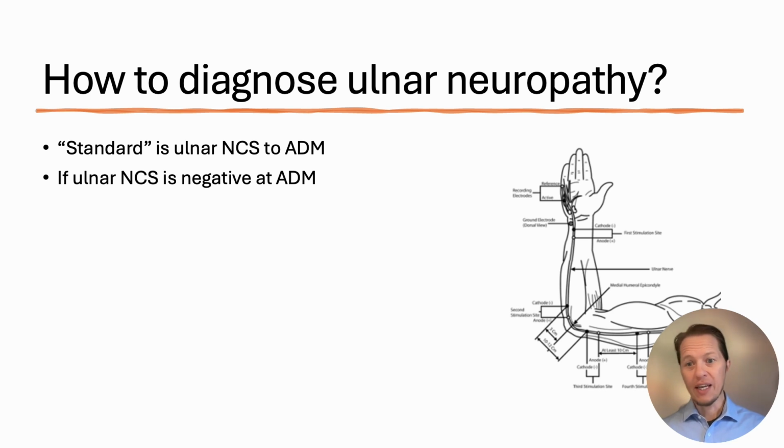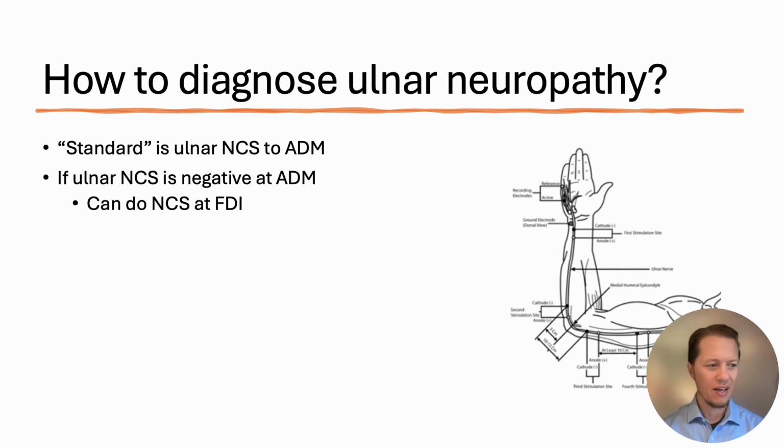But it's often negative. It just comes up completely normal. And well, the next step is, yeah, you got to do it at FDI. Some people are like, oh, I don't feel like doing it. That's annoying because we just never got used to doing that. It might save you like 1 minute to only do ADM, but you add on FDI, it adds maybe 1 minute to your day. It's not that big of a deal.